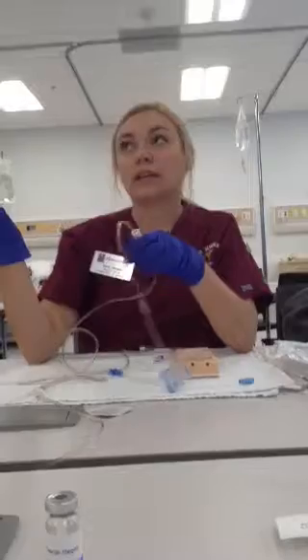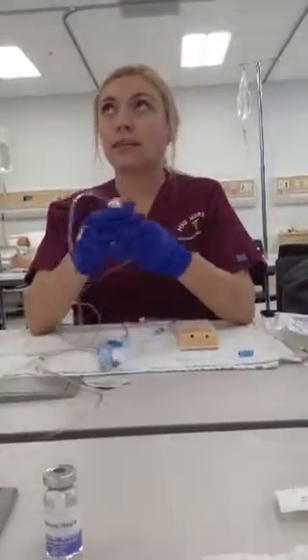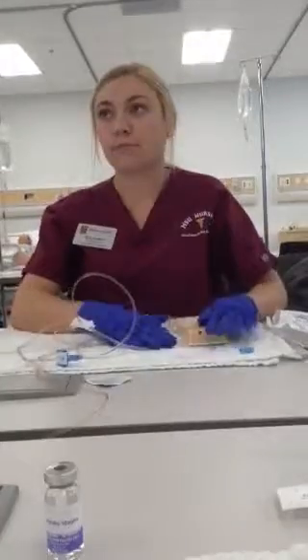And then once the medication has stopped, I'm going to go ahead and switch it back over to my normal saline into my primary tubing and assess the site for any issues as well as side effects that could have occurred.